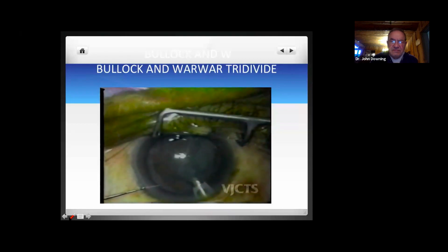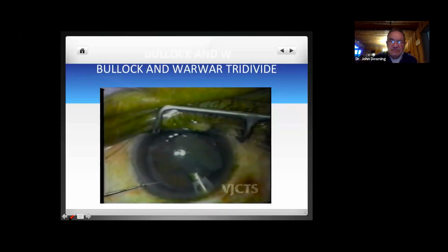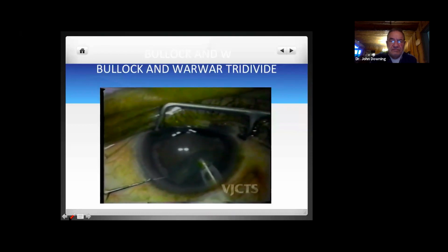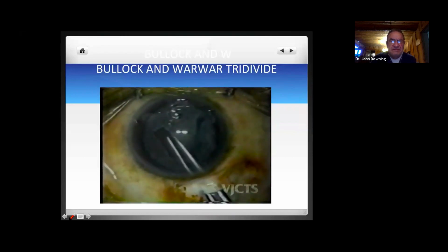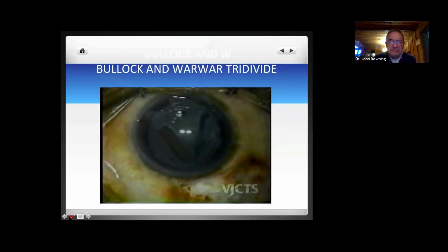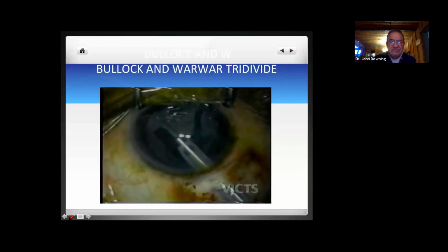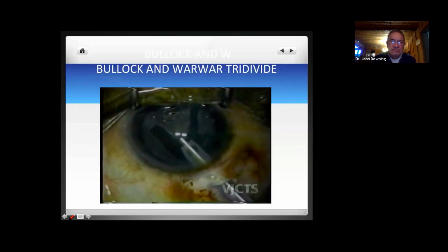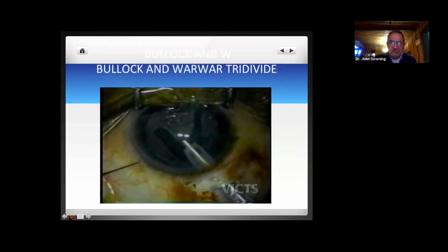Note the fragment to the right is now spontaneously dislodged by the movement of fluid, and we did not do any manipulation to free that fragment. Approximately 30% of the radius from the center of the nucleus to the right, you go 30% of the way and make the first groove. You then swing over at a 30-degree angle and make the second groove, and that gives you then 3 equal pieces.